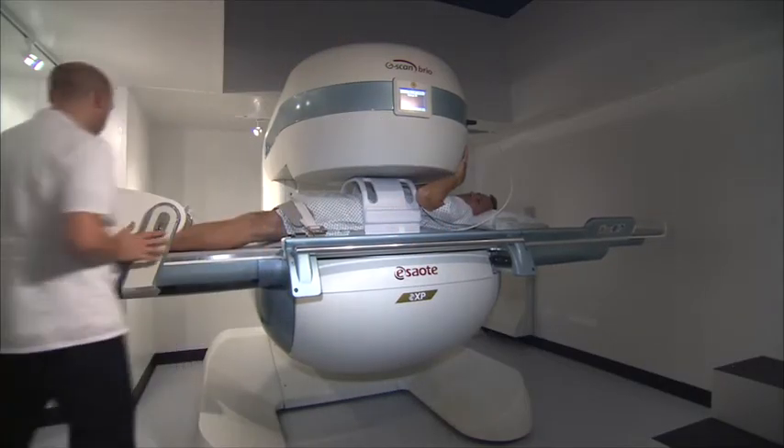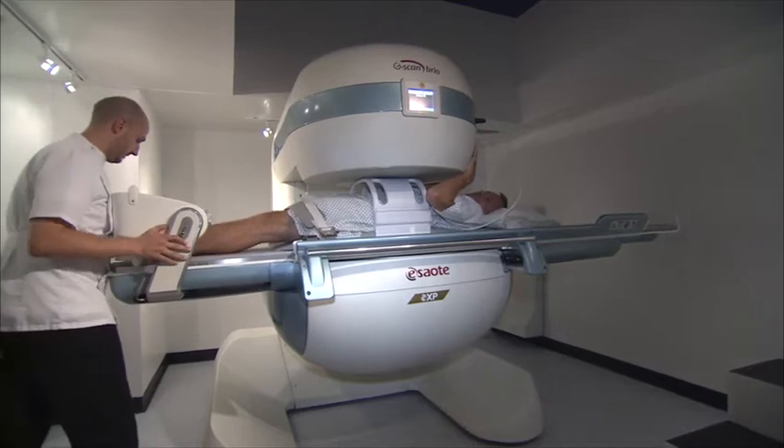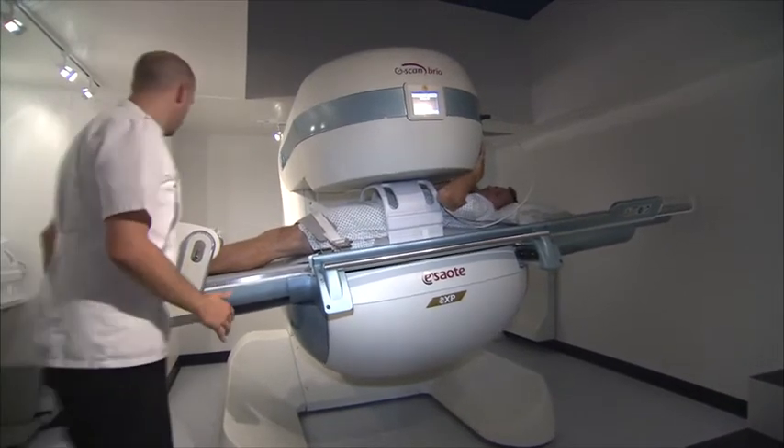It's not really any benefit for them having the scan that way. If we move those claustrophobic patients across onto the G-scan, they all like it a lot more because it's a lot more open and they tolerate it really well. With a conventional scanner, patients having their hands scanned would have to keep them alongside their body or in a superman position — lying quite uncomfortably for a long period. Whereas on this scanner, they can just move the table so that the hand is in the centre of the magnet, which is so much more comfortable.